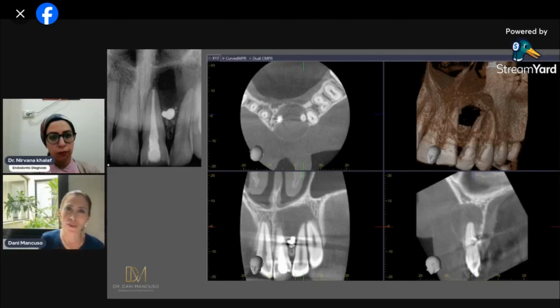The patient sometimes felt it, sometimes didn't. So I said, let's just wait. I won't treat that. I will go just for the obvious ones. And I did the whole retreatment of the central, and then treated the lateral. And at the same time, I opened up for the surgery and did a small decompression, removing that material that I didn't know what it was. So I decided to remove it.